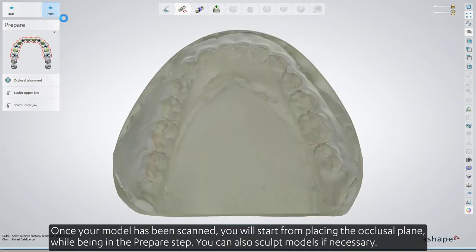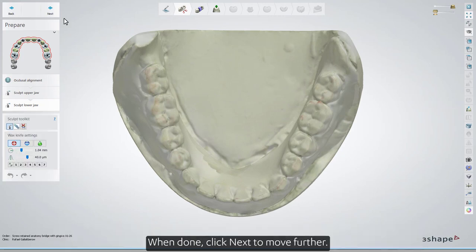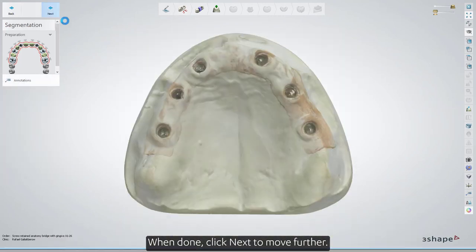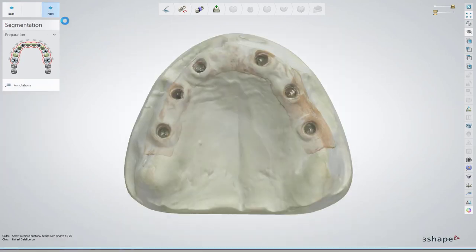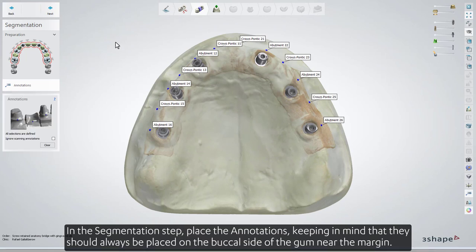You can also sculpt models if necessary. When done, click Next to move further. In the Segmentation step, place the annotations, keeping in mind that they should always be placed on the buccal side of the gum near the margin.